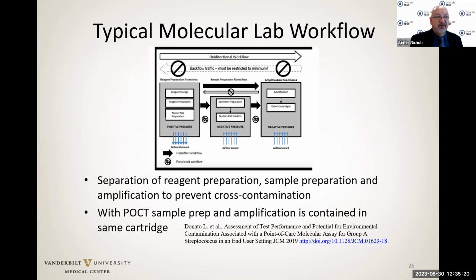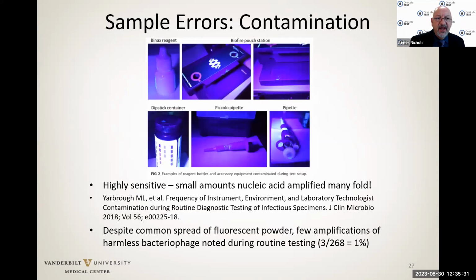So we were very concerned, even with unit use devices, about the potential for environmental or cross-sample contamination when we implement these, particularly in busy workflows, places like the emergency room or other high volume types of testing environments.